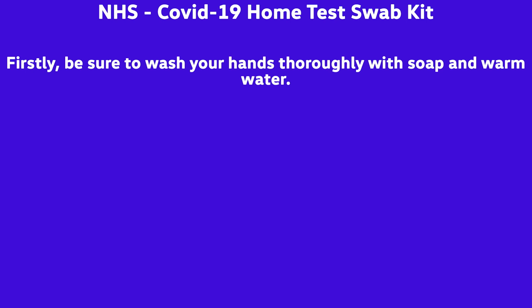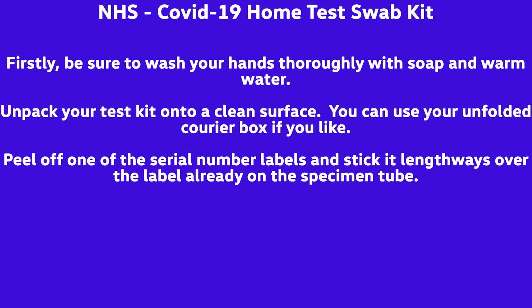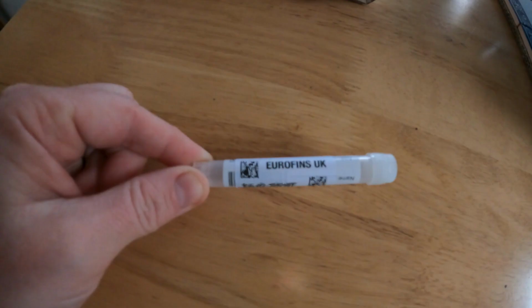So let's get started. Firstly, be sure to wash your hands thoroughly with soap and warm water. Unpack your test kit onto a clean surface. You can use the unfolded box if you like. Firstly, peel off one of the serial number labels and stick it lengthways over the label that is already on the specimen tube.